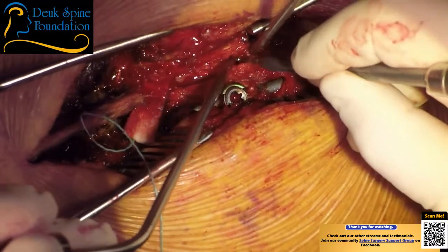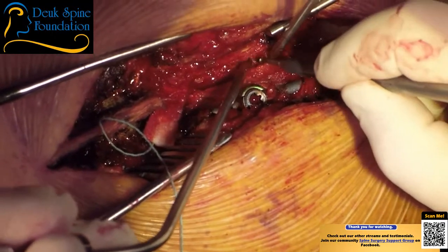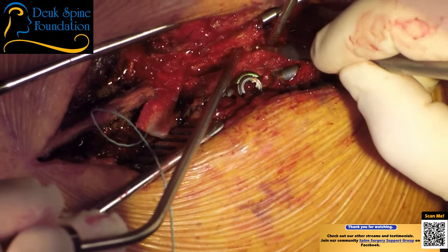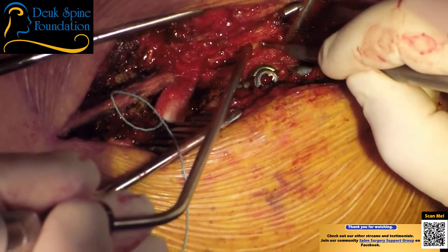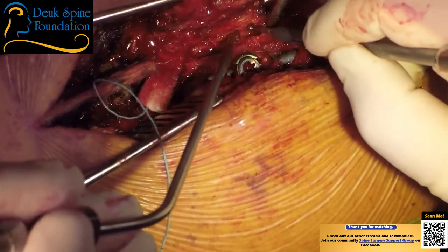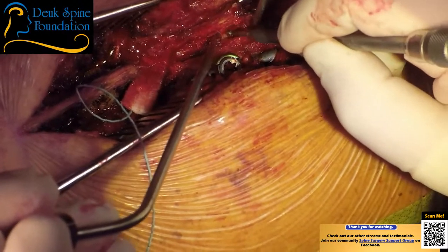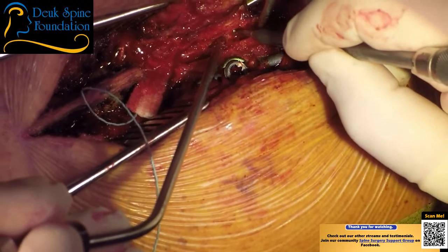See if I can break through. I must have an eggshell right there. It seems like I'm through. It's hard to tell. I think I'm through right there. The problem is this is the best place to break through into the epidural space, but it's also the most dangerous because that's where the cord is compressed the most. But it's also where there's no ligament. See, there's no ligament at the top of the lamina. It attaches to the very top, but there's no ligament like in the top half on the dura. So it's a clean area, and ligament is usually what sticks the bottom of the bone to the spinal cord.